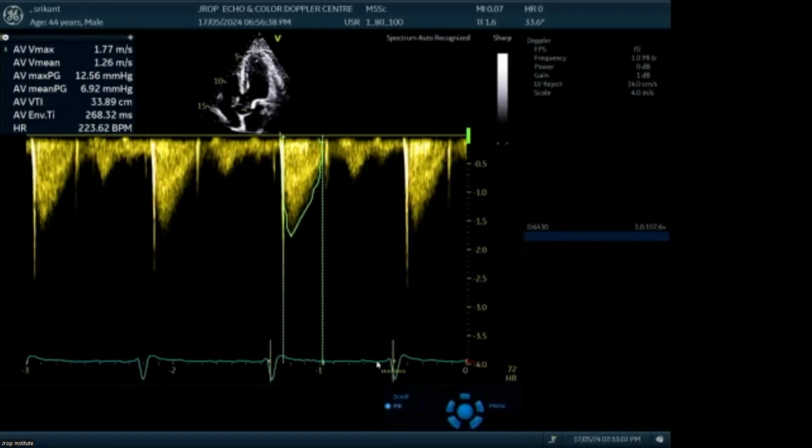End of the T wave to the beginning of the QRS complex would be diastole. But all of us understand that the mitral valve closes and the aortic valve opens. There is a word which is known as isovolumic contraction time. Similarly, the aortic valve closes, the mitral valve opens. That is known as isovolumic relaxation time.